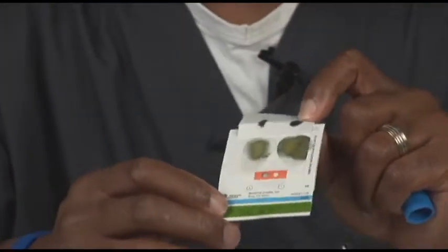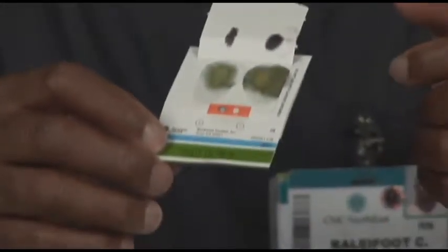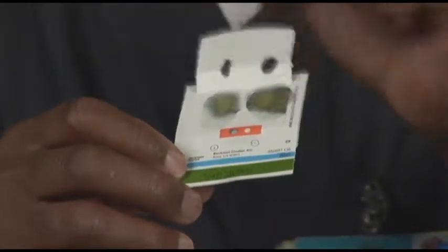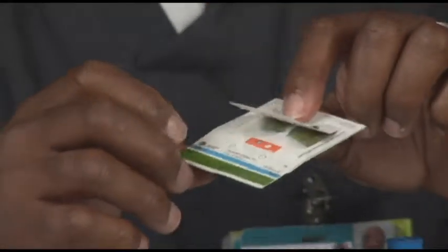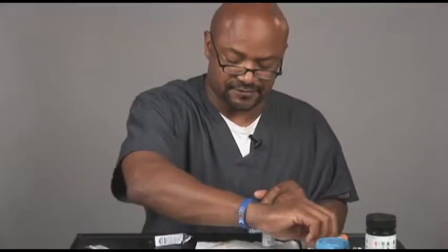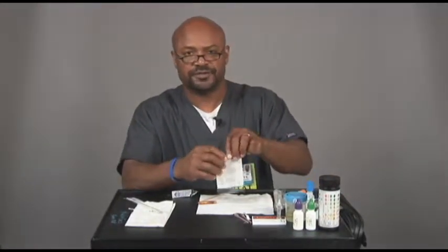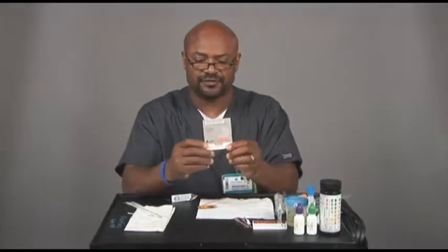Normally you don't get that pretty colorful blue. You can if the stool is grossly positive. Normally you'll see a faint blue, and that still is recorded as a positive result. If you don't have a color change, it's recorded as negative. The next type of point-of-care test we use for looking for occult blood is the gastrocult.